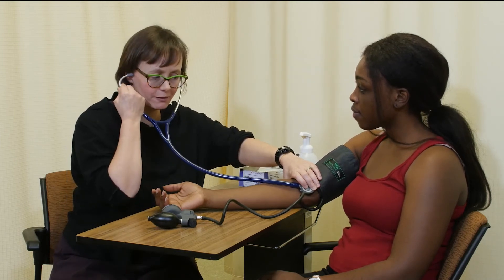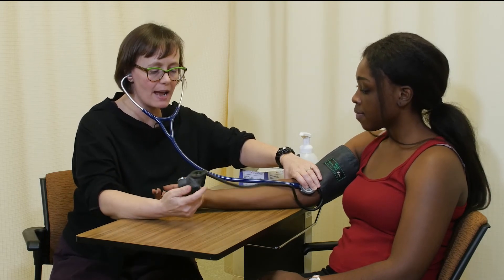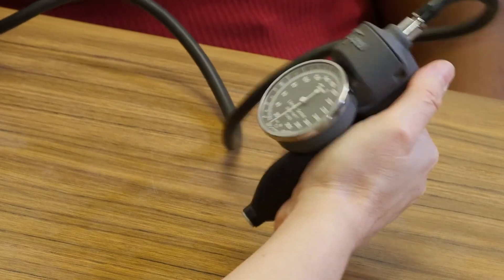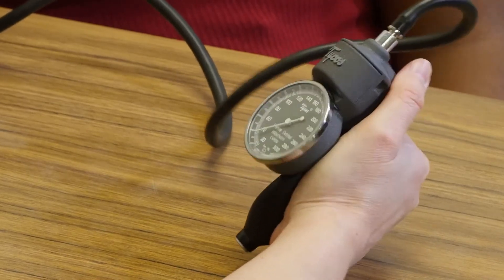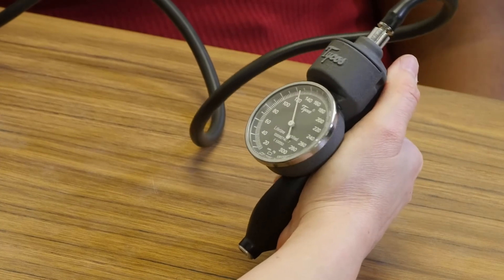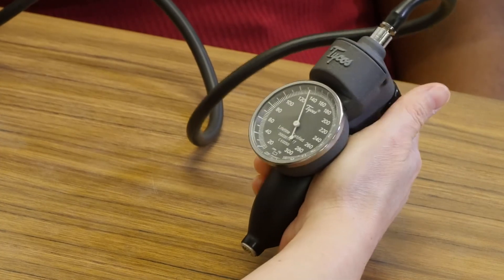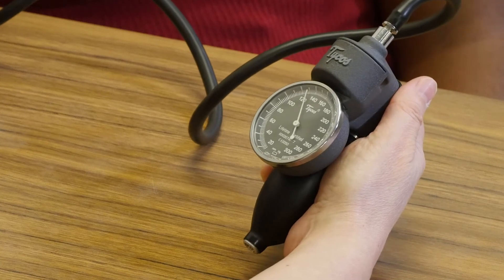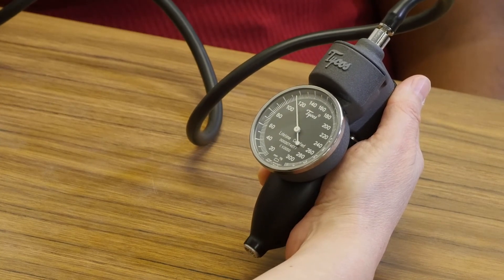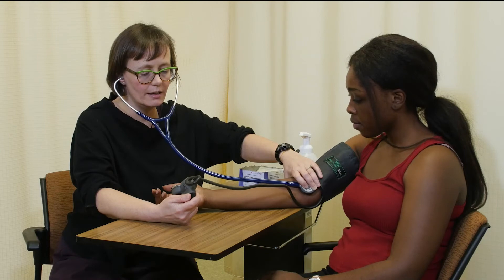I'm going to inflate the cuff — you're going to feel a little bit of pressure on your arm now. I'll close the valve and inflate the cuff to 130 millimeters of mercury, then slowly deflate, noting the systolic and noting the diastolic, and then quickly deflate.